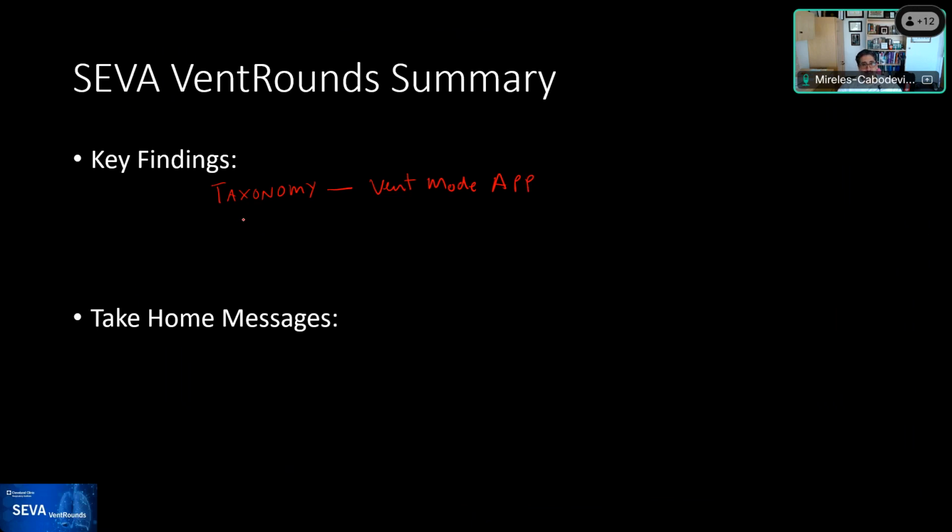We reviewed what the 5 types of IMV are, and we saw one in which it was type 2, so it suppresses the mandatory just by the presence of a respiratory rate, and we saw type 5, in which we see spontaneous breath becoming mandatory by the sake of a minimum inspiratory time. And in this case, the patient also had features of high resistance, and that was leading to 2 discordances: late trigger and failed triggers.